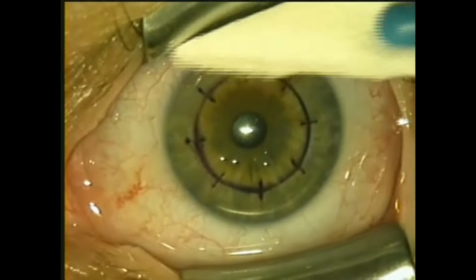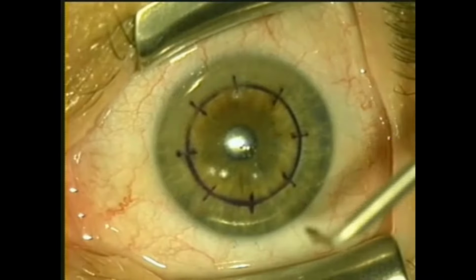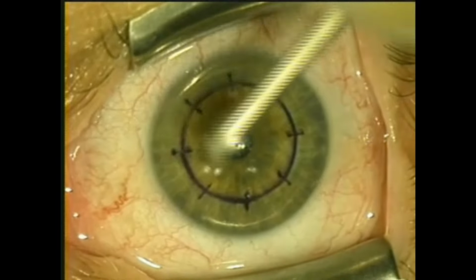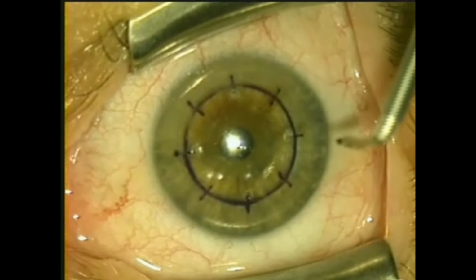And then we'll dry a little bit. At this point, we'll apply the radiofrequency energy through the insulated probe, which is 450 microns in length. It's depressed into the eye completely, and then the pulse of energy is applied, as you can see here. The probe is placed in, and the energy is applied. You get a very small lesion, much smaller than that seen with laser thermal keratoplasty. And what we do is we apply them first in the 6 millimeter zone, walking around.